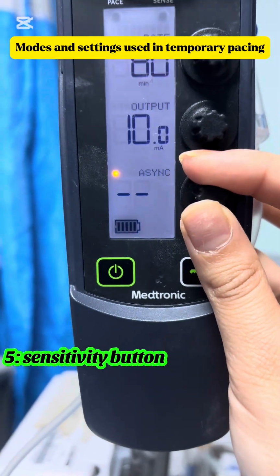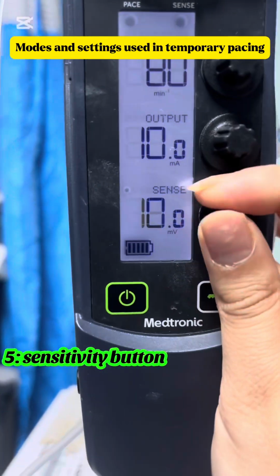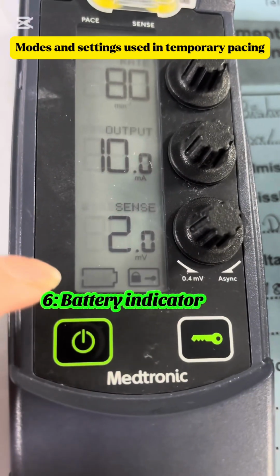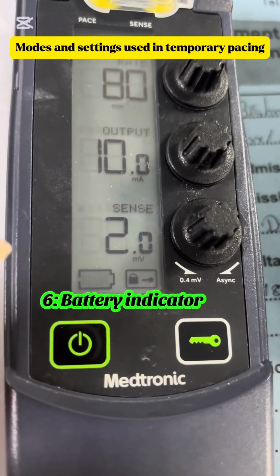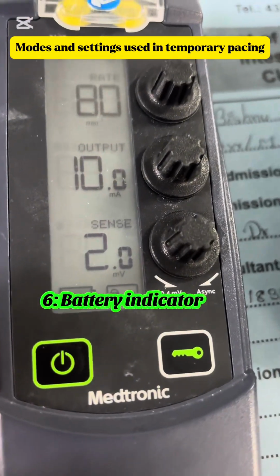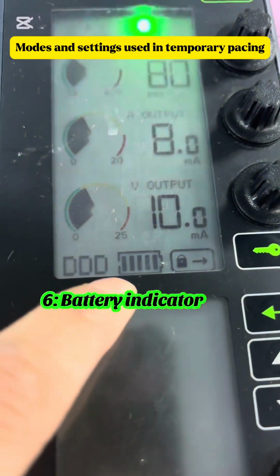And higher the number, the less sensitive; lower the number, more sensitive. It is a battery indicator. Here the battery is low, so the pacing box shows a red light flash behind the battery indicator. Whereas in another pacing box, the battery is fully charged.